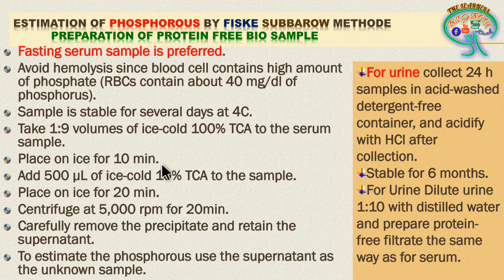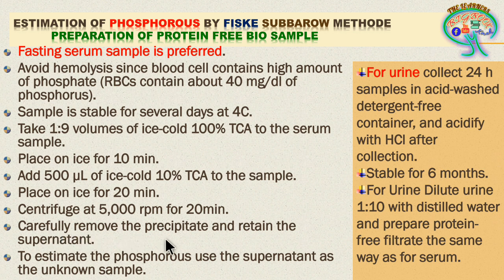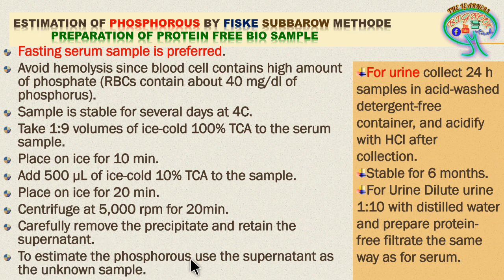Place the mixture on ice for 10 minutes after adding the TCA. Then add 500 microliters of ice-cold 10% TCA to the sample and incubate on ice for 20 minutes. Centrifuge at 5000 rpm for 20 minutes. After centrifugation, remove the precipitate and retain the supernatant. The precipitate contains proteins, as TCA precipitates protein. Use the supernatant as the unknown sample, which contains the phosphorus released from blood serum.